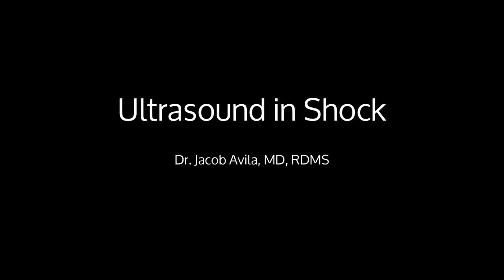Hi, this is Jacob Avila of 5 Minute Sono, and this is how you use ultrasound in the evaluation of shock. When you're doing this exam, you're basically doing what's called the RUSH exam, and that's rapid ultrasound in shock and hypotension.